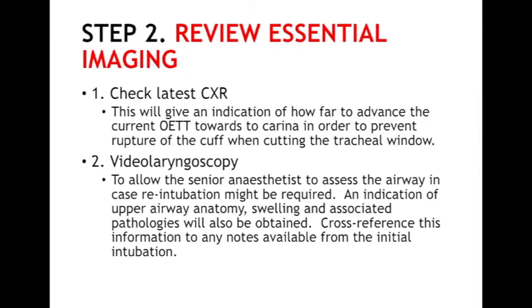The most recent chest x-ray will give an indication of how far the oral endotracheal tube can be advanced towards the carina at the time of tube exchange, in order to minimise the chance of inadvertent deflation of the cuff by tracheal incision.